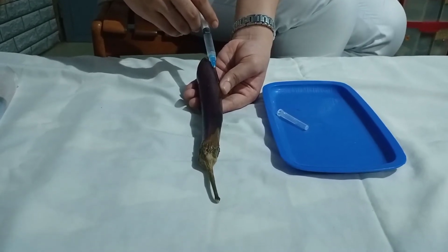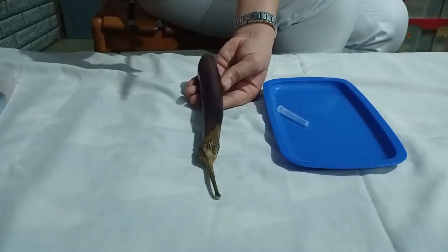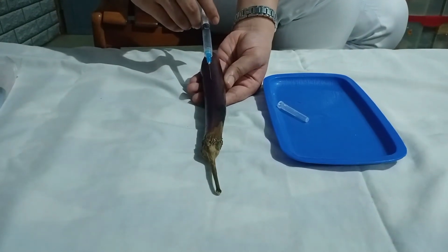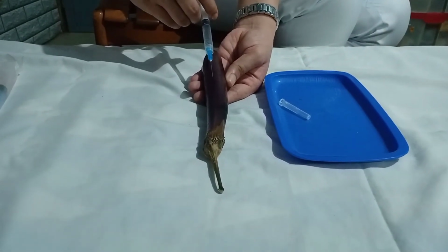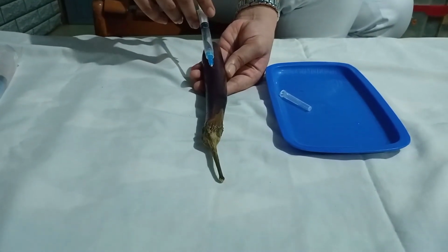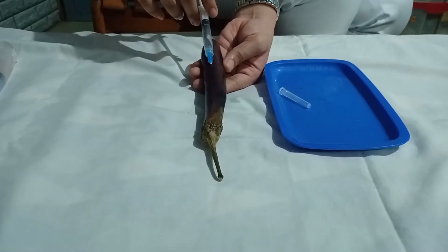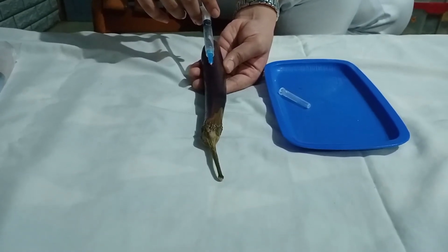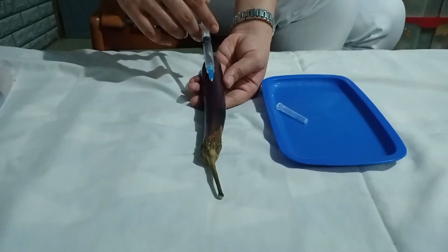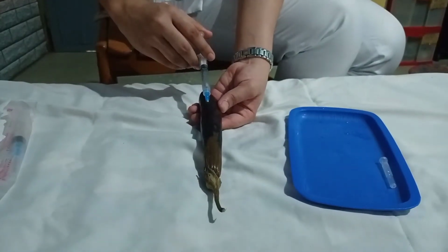So aspirate the plunger to determine whether the needle is in the correct site. The rationale for this is to determine if you have hit a blood vessel. If blood is present, you withdraw the needle and restart with a new needle. Then I'm going to inject it slowly and make sure that it is in a flat position. Now release the medication.